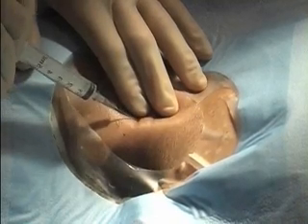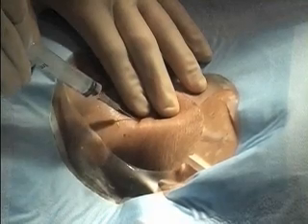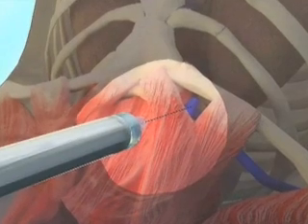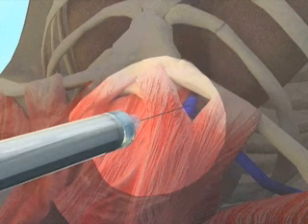Advance the needle while applying gentle suction to the syringe. Continue to aim toward the ipsilateral nipple at a 45-degree angle to the skin, avoiding penetration into the deep tissues of the neck. Typically, the vein is accessed at a depth of less than 1/2 inch, or 1.